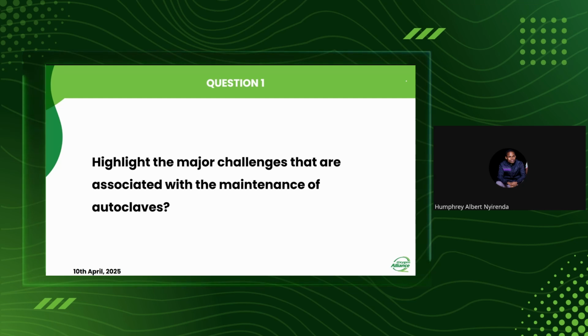In areas with such water, which is normally called hard water, when you use it, it causes scaling in the steam generator, and the salt in the water also facilitates oxidation on the coating of the element, which affects the effectiveness of the element. So you face issues like temperatures declining, fluctuation in the sterilization temperature, or the pressure not building up in the chamber or in the jacket.